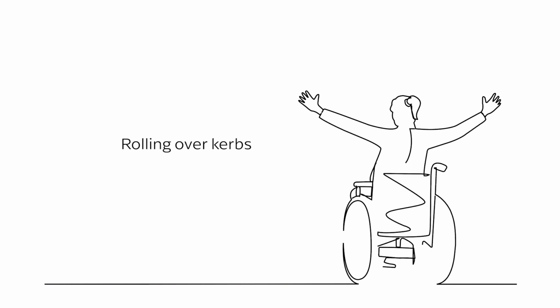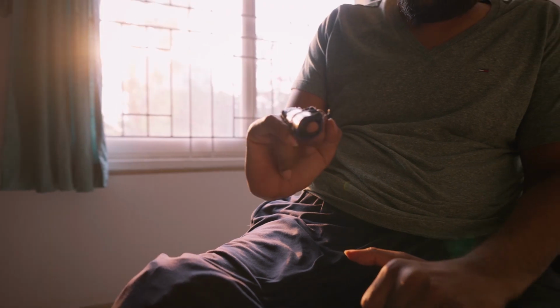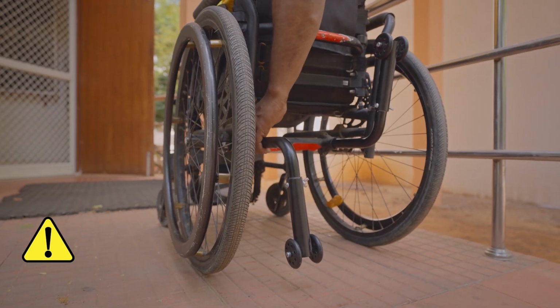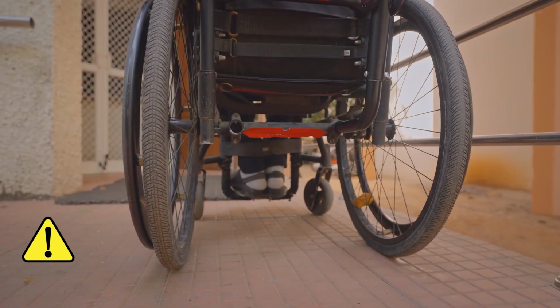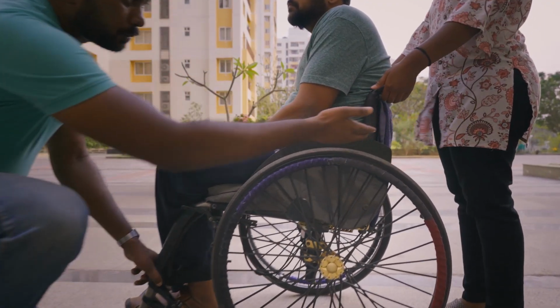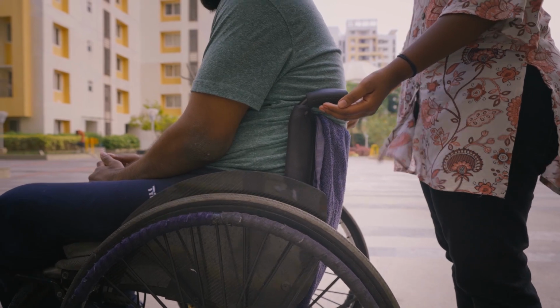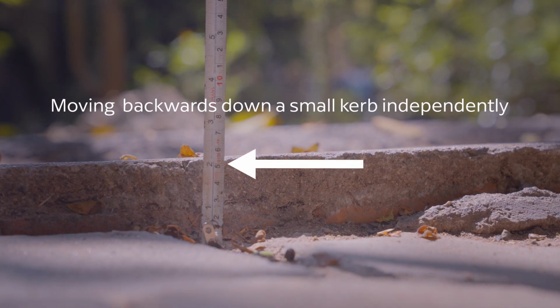Rolling over kerbs. Prerequisites. For these maneuvers, you require good upper body strength and trunk balance. Caution: before you start practicing, adjust your anti-tippers. Wear a helmet. During practice, have the assistants stand behind with their hands ready to grab the push handles to prevent a fall.